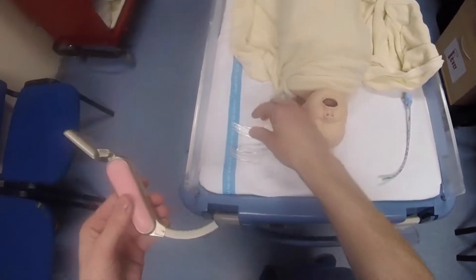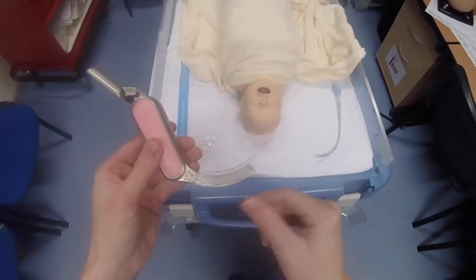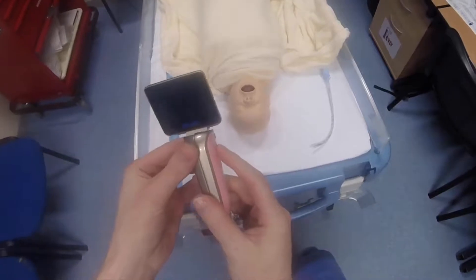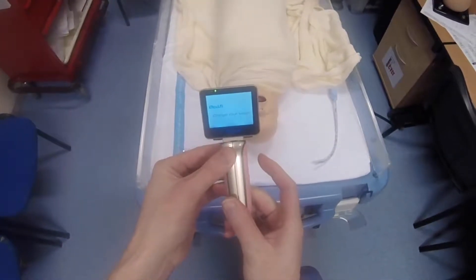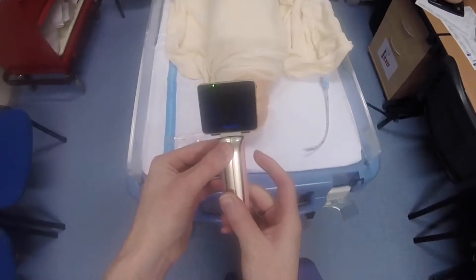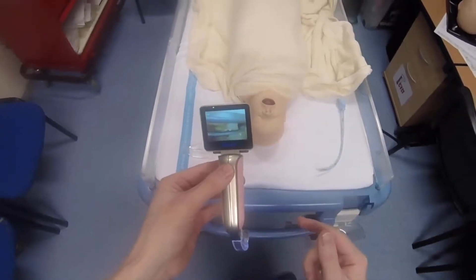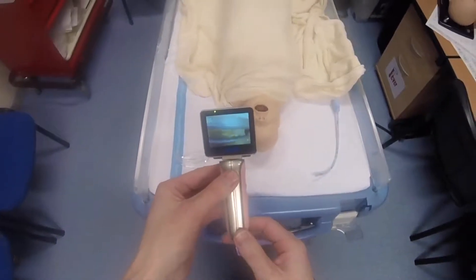Clipping the blades on is pretty straightforward — they just push on and lock into place. To turn the laryngoscope on, it's just a long hold of the power button. Load-up time is pretty quick and the laryngoscope is ready to go in about 15 seconds, which is the time needed to get the anti-fog mechanism working.